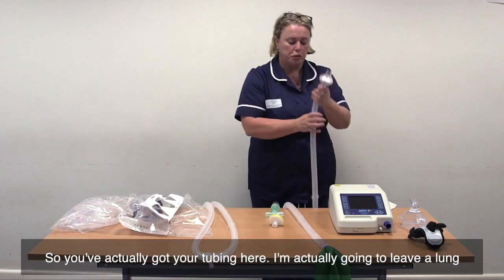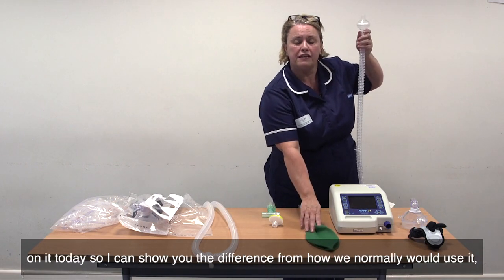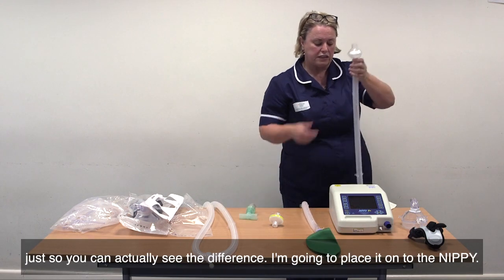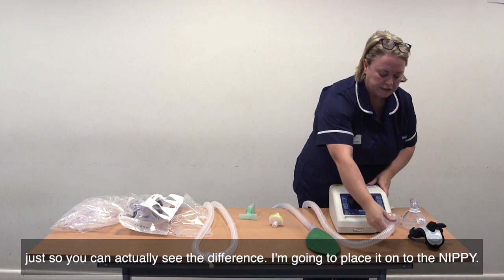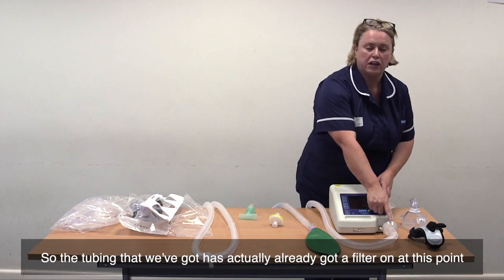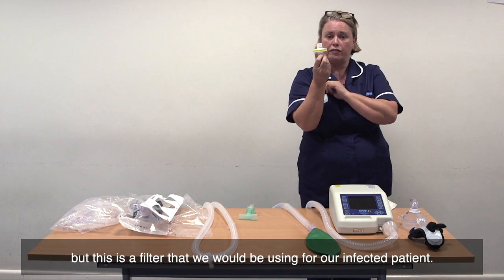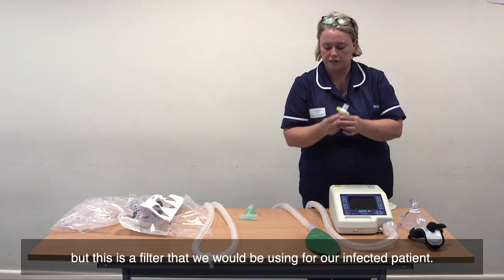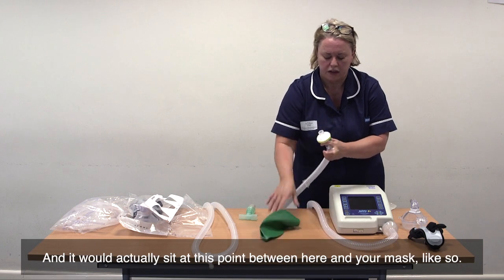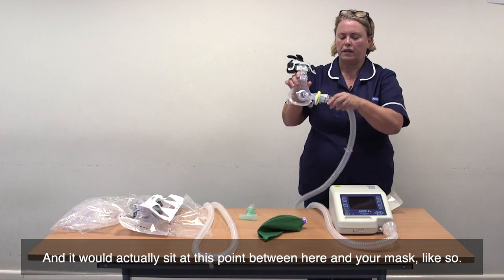So you've got your tubing here. I'm going to leave a lung on it today so I can show you the difference for how we normally would use it. I'm going to place it on to the NIPPY. The tubing has already got a filter on at this point, but this is a filter that we would be using for our infected patient. It would actually sit between here and your mask, like so.